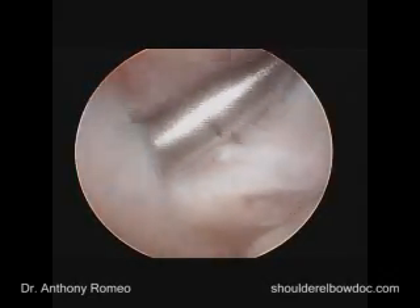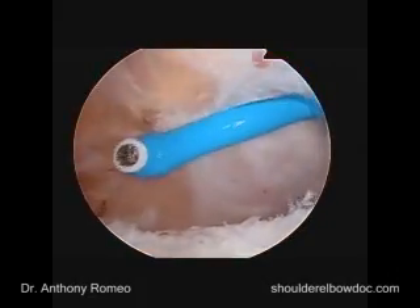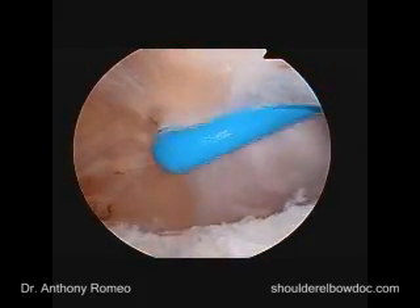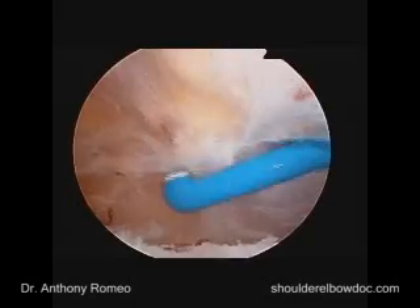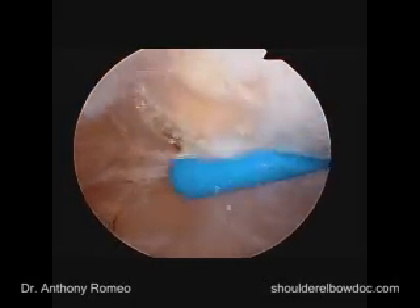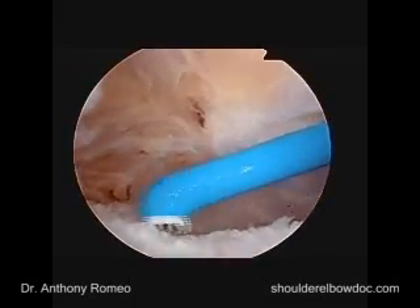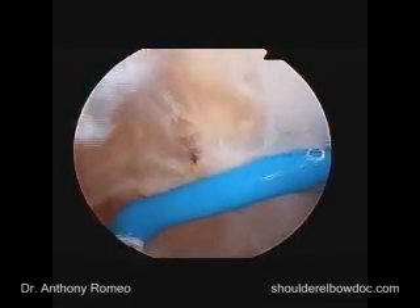We want to define the whole lesion we see here in terms of the subscapularis. As we get some bleeding in the space behind the coracoid — the subcoracoid space — it's typically related to this bursal-type tissue. Using the opus wand, we are able to coagulate that bleeding and take care of this issue.